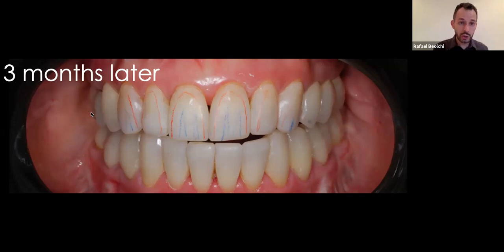Okay, so you should do all the steps in polishing immediately after you did, but know that after 2 weeks, it is easier and gets better. Okay, exactly what is my protocol. On both days, immediately after and 2 weeks after, this is my protocol. I start from the rougher to the softer. So it is 4 steps.